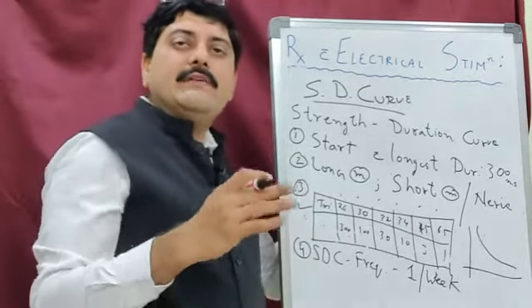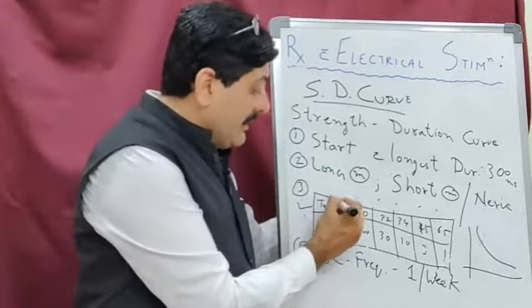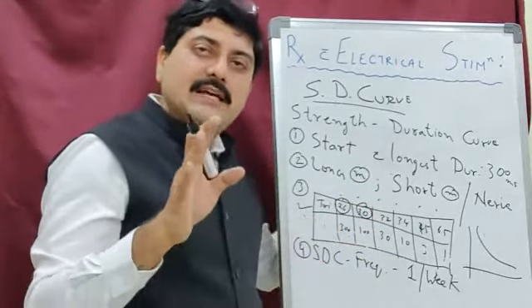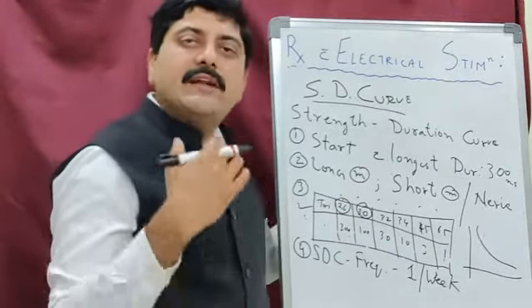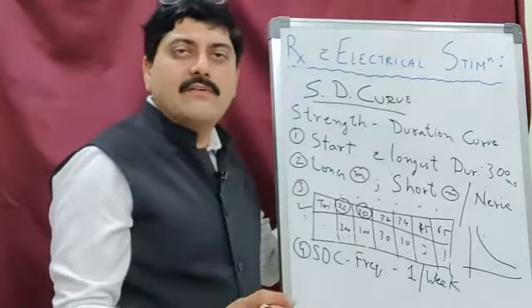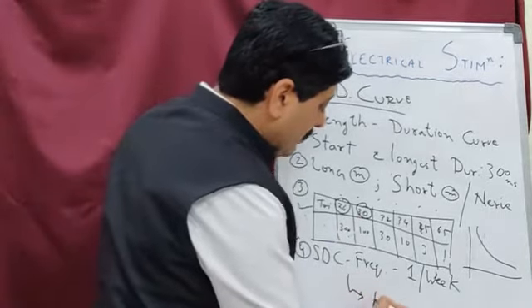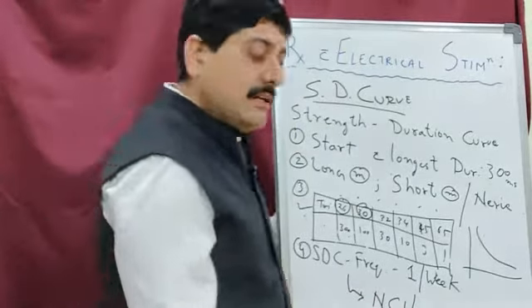And secondly, you can even have evidence with you that the stimulation intensities are reducing as the weeks are progressing. If the intensities are reducing, that means that the nerve is recovering. If the intensities are not reducing, that means the nerve is not recovering and it needs further testing. So beyond this, there is something known as nerve conduction velocity studies, right?